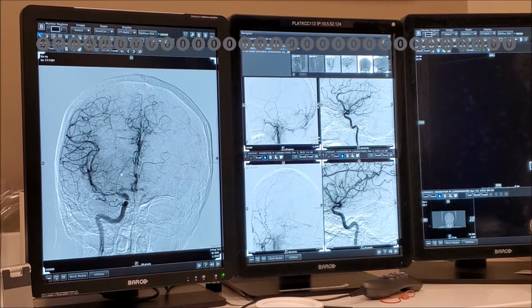Uh-huh. So this is right, it's medial tentorial. It's exactly where the tent is coming down, okay? If the same vessel coming from the C5 segment, but you see it in the AP goes straight like this, it's called basal tentorial, okay?